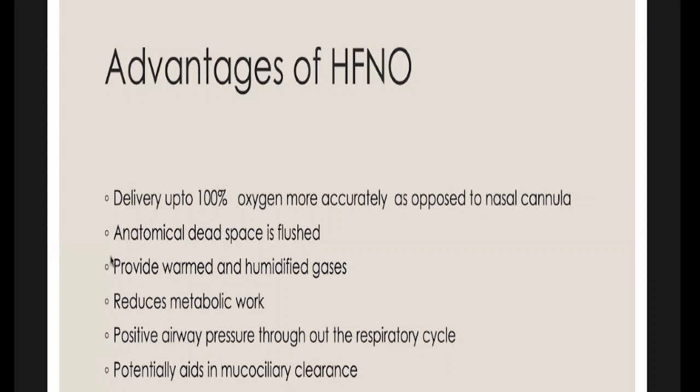At the same time, the positive airway pressure throughout the respiratory cycle is being maintained. So it's a little similar to a CPAP, continuous positive airway pressure. During inspiration as well as during expiration, this high flow oxygen is being kept. It's as if you are sticking your head out of a moving vehicle. Imagine a gush of wind coming in and rushing into your face. That sort of feeling will be there for the patient when they are on high flow nasal oxygen.